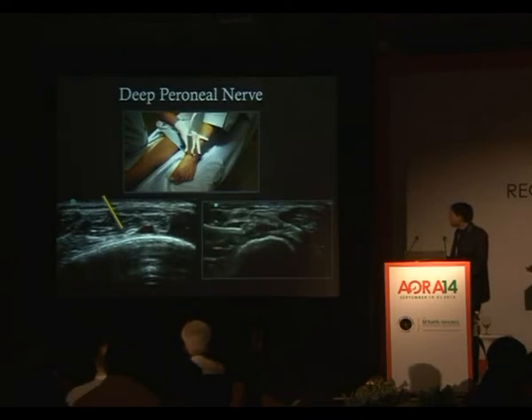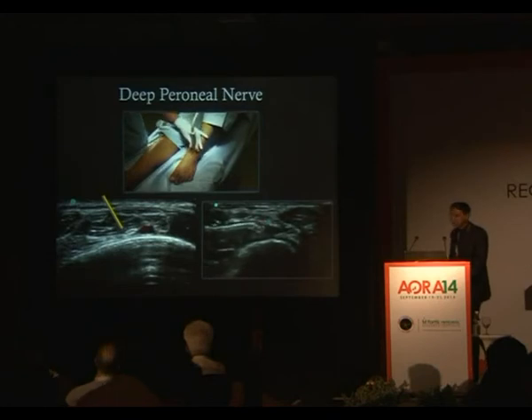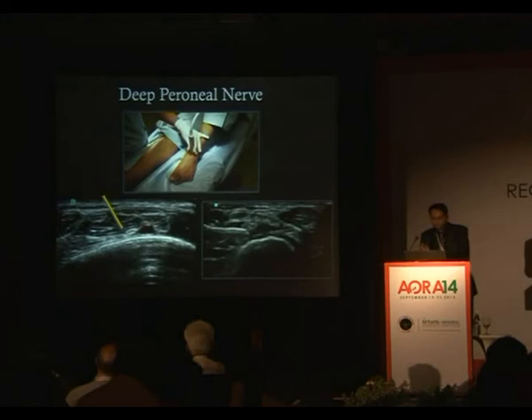You can see the arterial pulsations here. This is the deep peroneal nerve. Again, very, very tiny. This requires you to have a very steady hand and a lot of patience in trying to find the nerve.